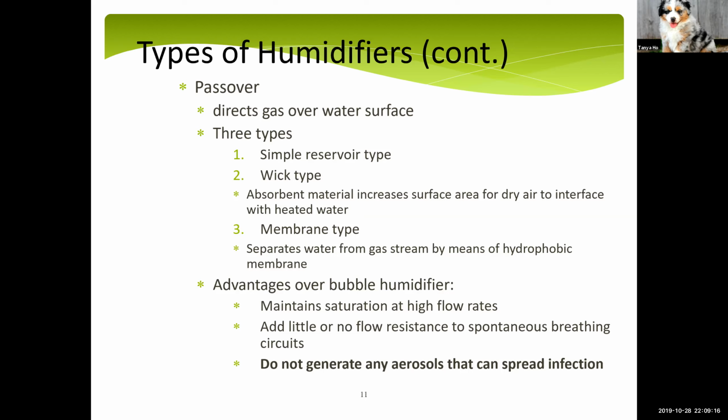I don't think it's as common as the other two. It just is a passover, a simple reservoir type, but instead of having direct contact between the gas and the water, the water is separated from the gas by just a membrane.